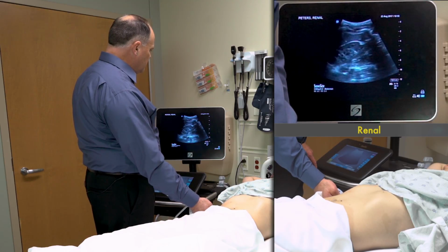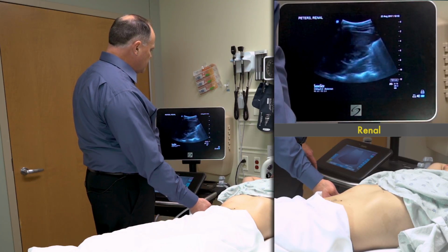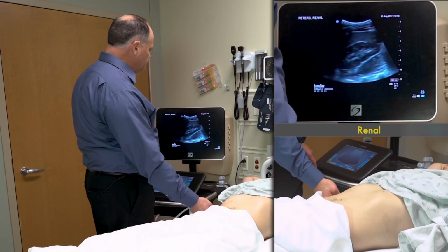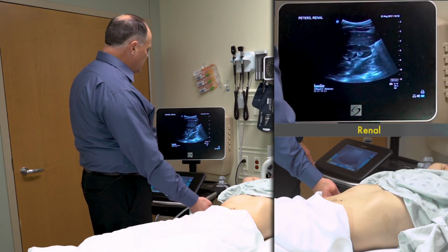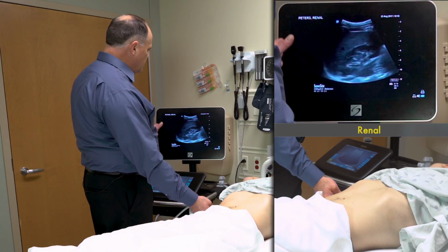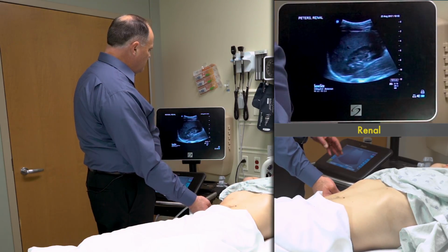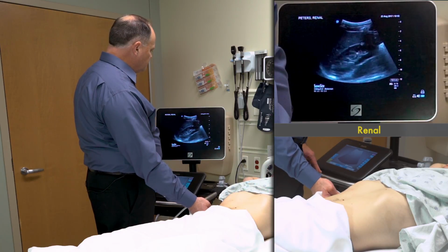And you want to fan through the kidney, anterior to posterior, to see if you see any shadowing stones in the kidney as well. Now again, if you're having trouble seeing part of the kidney, you can ask your patient to take a deep breath hold. So if he goes ahead and takes a breath, that drops the diaphragm down, gives us more acoustic window and a better view of the kidney.